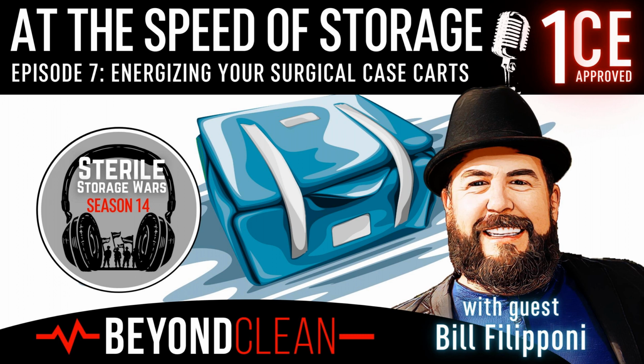Well, a couple of minutes ago, Justin cut you off on the workflow of the case cart. I think we pick the cases and we send them to the OR, but there's a little bit more that happens with that. Sorry, I just love opportunities to throw Justin under the case cart. So yeah, pick us up. We've scanned them. They're going up to the OR. They're outside the room. Then what happens?